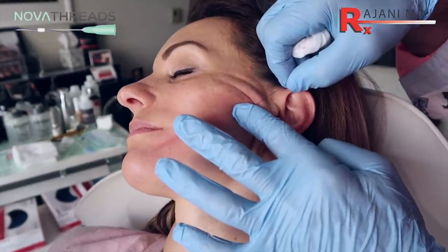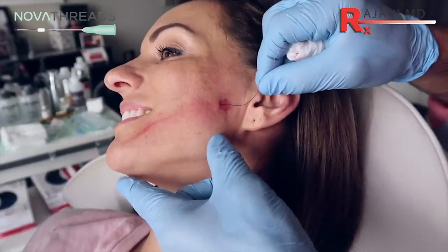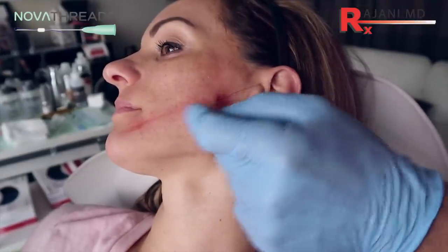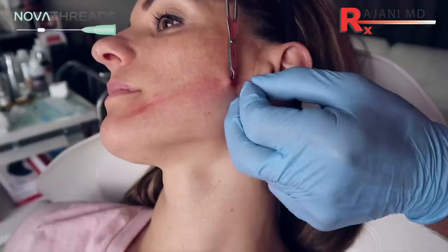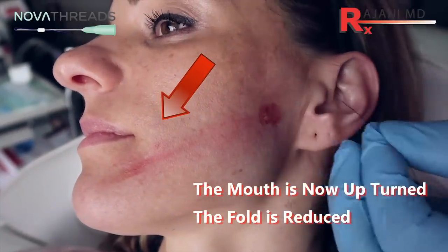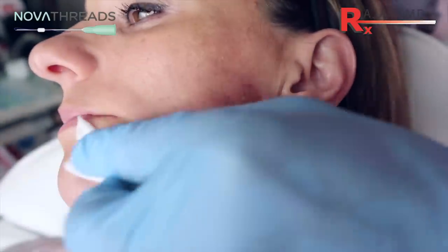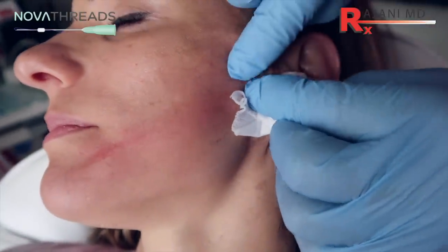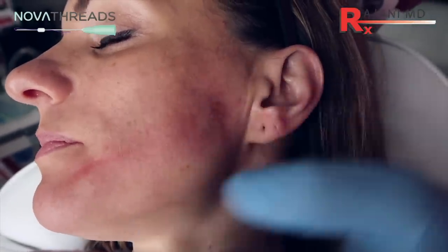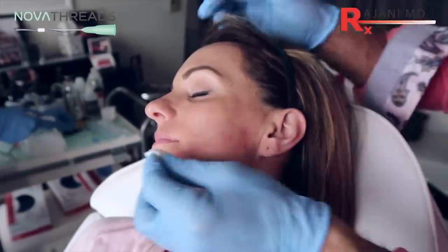It wasn't deep to begin with, but that means you get a perfect candidate for that. Now have the patient animate — smile for us. Looks perfect; you can't see the thread. I can now pull it out. If it didn't look perfect, I would adjust the thread — I would unzip it, so to speak. This is important: I want to bury the thread. Just the tip of the scissors, push down, clip the thread and the thread only — not the skin. Get rid of the thread. I still engage it one more time so you bury the edge of the thread, then we can get rid of our marking, lift it up. You can feel it lifted up — get the patient to smile again. It's perfect; there's no visibility of any thread.